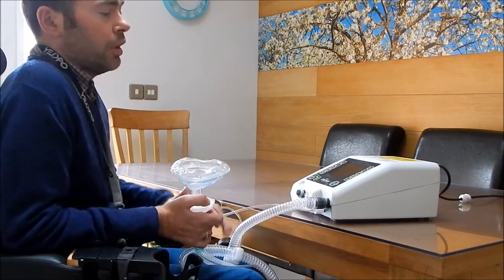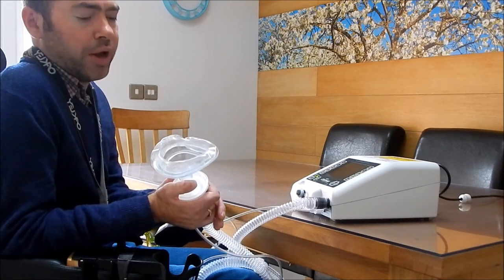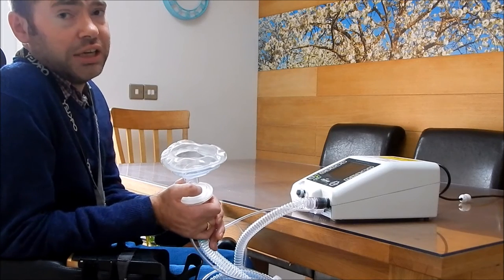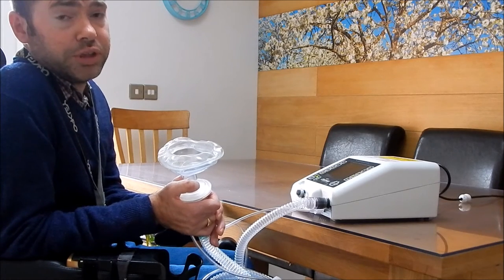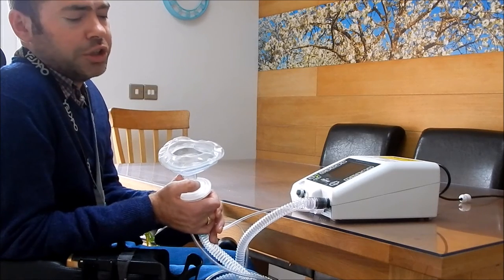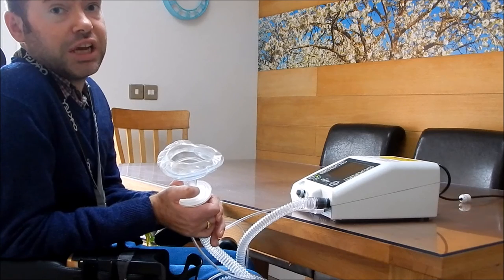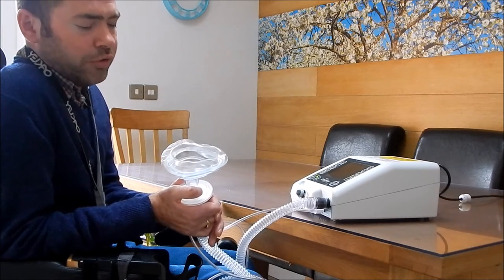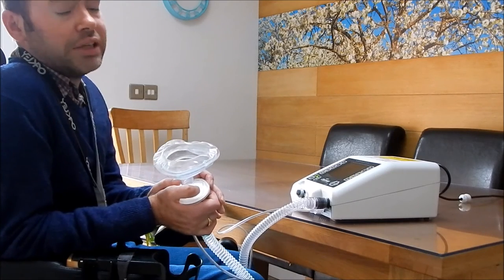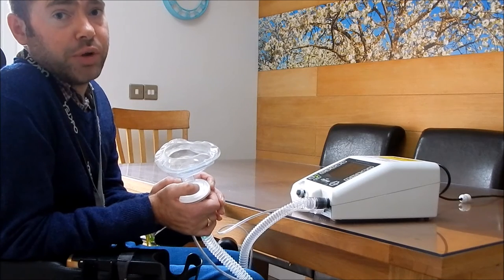Basically the machine is there and you have a mask with a pipe on and a filter. It's important to keep the mask clean especially after you've used it, because if you've got a cold or anything like that, your germs will stay on it and then you're just recycling your own germs. Filter changes often as well. The mask can be just washed out with hot soapy water and left to air dry.